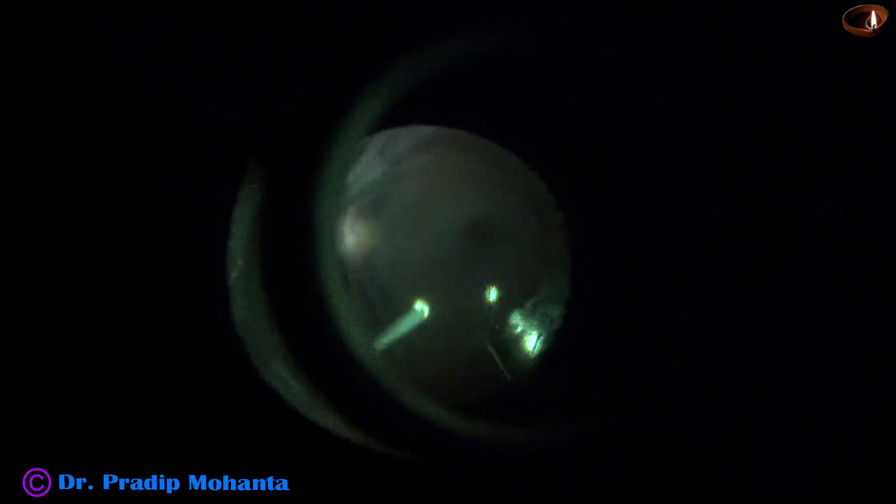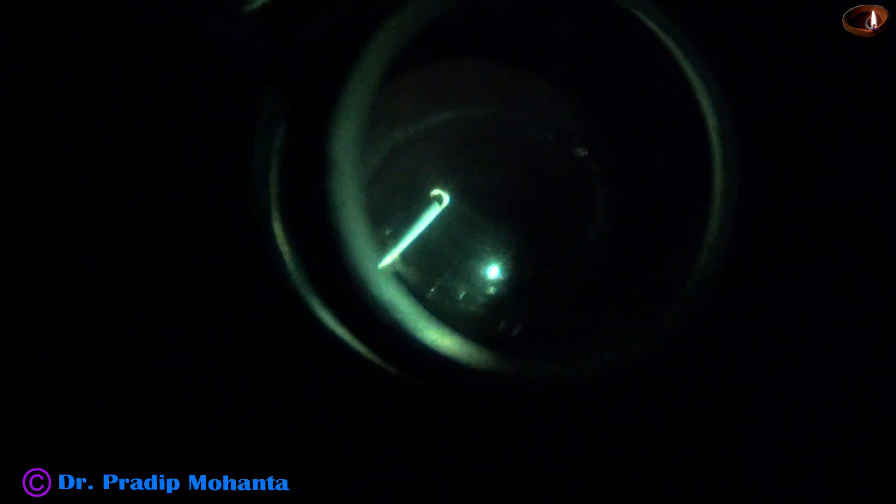Before we pull this intraocular lens out of the eye, we must make it free from vitreous strands. If the intraocular lens is entangled with vitreous strands and we pull it out, there can be a retinal tear and subsequently retinal detachment. So we have to do a very nice vitrectomy.